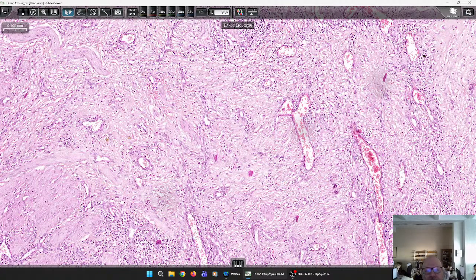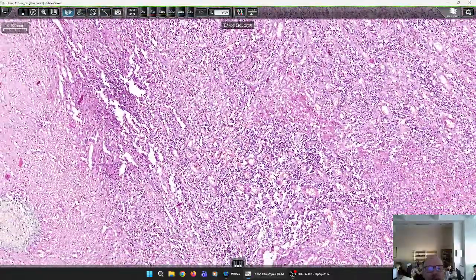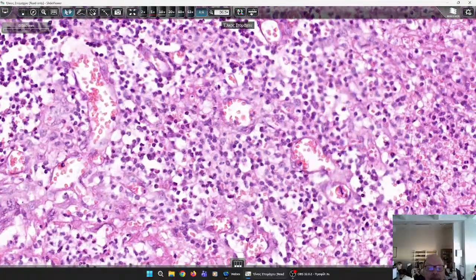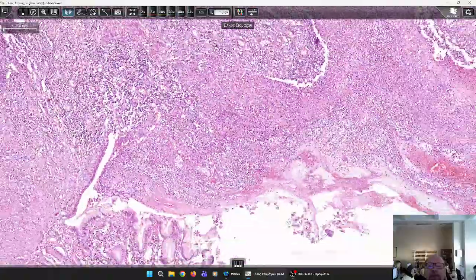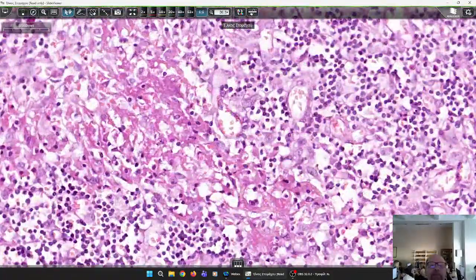Furthermore, another part of the ulcer is the necrotic tissue, which may be of the fibrinoid type. It's something like this, implicated here. However, it's more evident, the fibrinoid, I think this is fibrinoid necrosis, this area here.